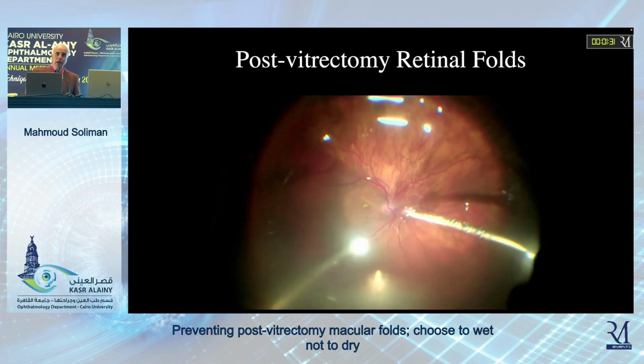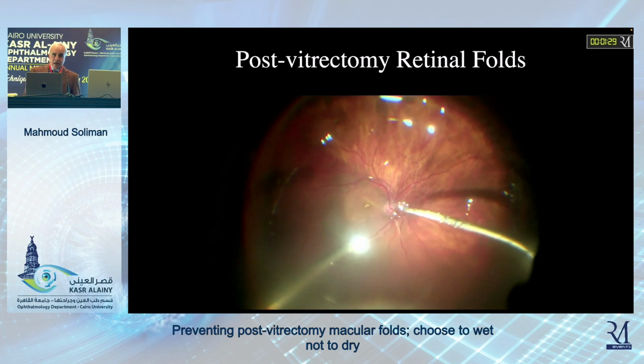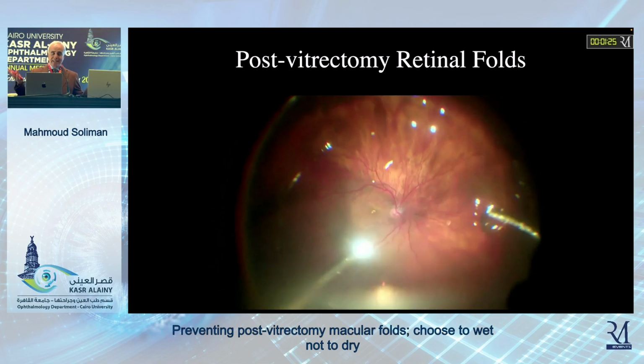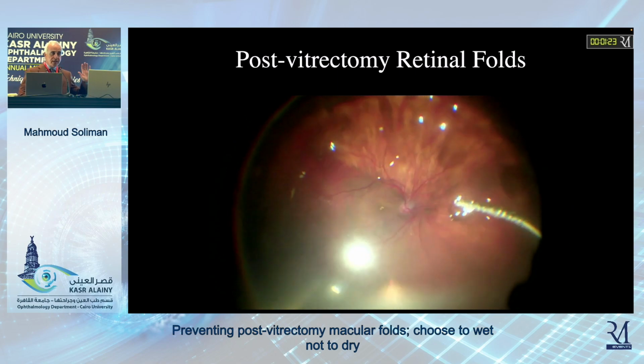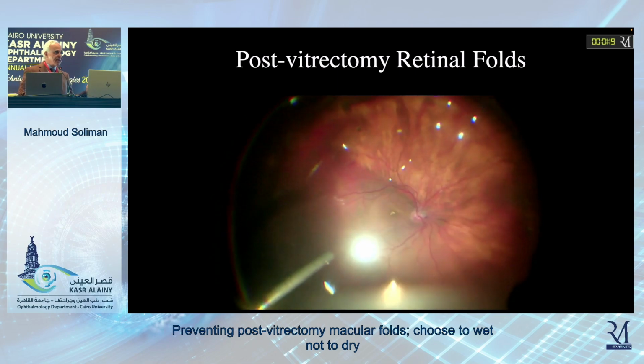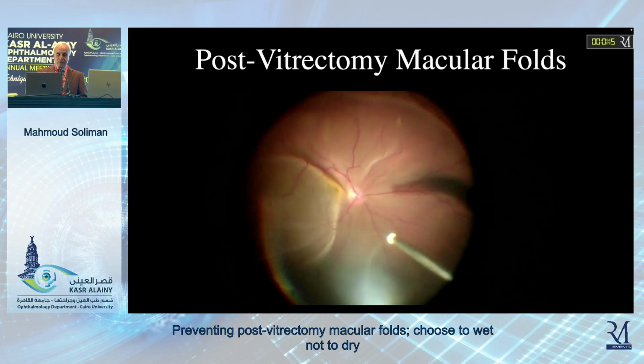So what will I do? Fill the eye with saline again. Choose to wet, not to dry. Don't insist on leaving the eye absolutely dry. This is wrong. So choose to wet, not to dry.